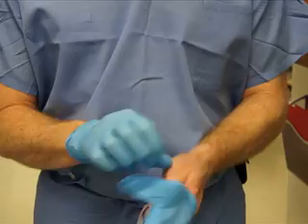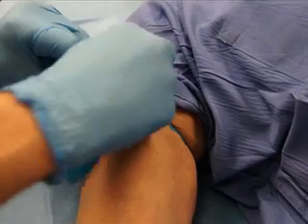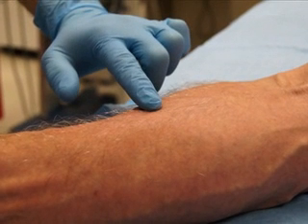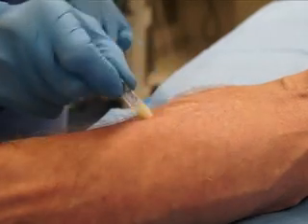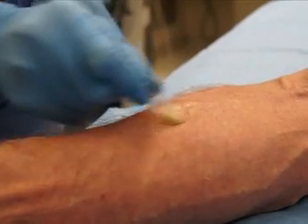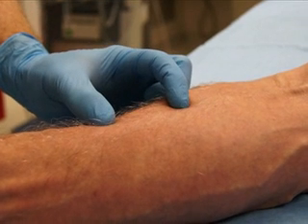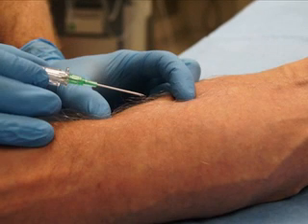Wash your hands and use universal precautions. Apply the tourniquet. Palpate or visualize the vein. Veins should be soft, elastic, and resilient, and should be pulseless. Clean the skin with the antiseptic swab. Stabilize the vein with the fingertips of your non-dominant hand. Hold the needle with your dominant hand between your thumb and index finger. Make sure the bevel is pointed up.